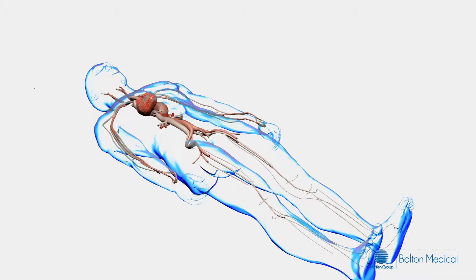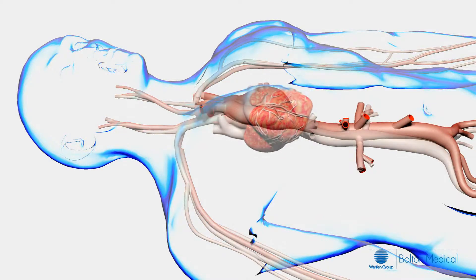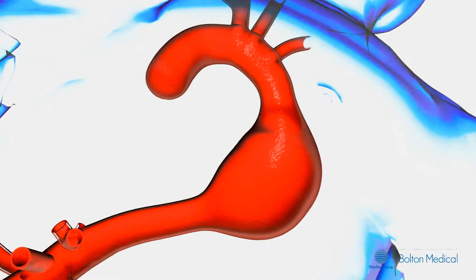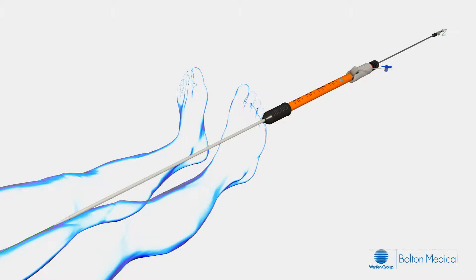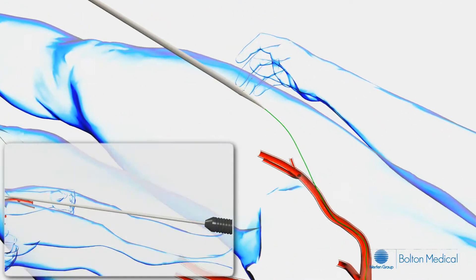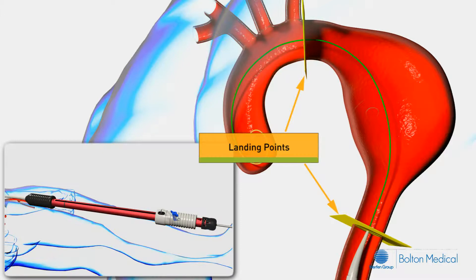We will now view an animation on the deployment process. Under fluoroscopy, introduce the PLUS delivery system over a 0.035 guide wire and advance until the tip reaches the approximate distal landing zone. Next, remove the orange shipping retainer by grasping the white tab on the end of the retainer and pull up to remove. Perform an angiogram and confirm the appropriate target landing zones.